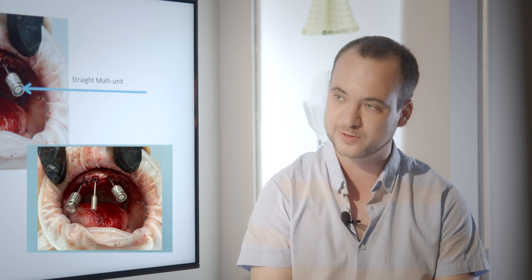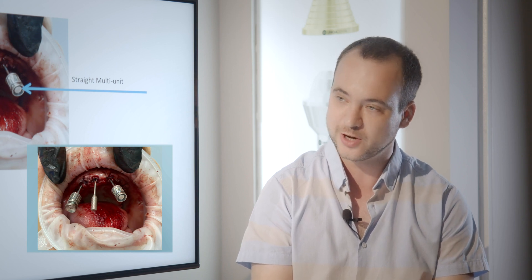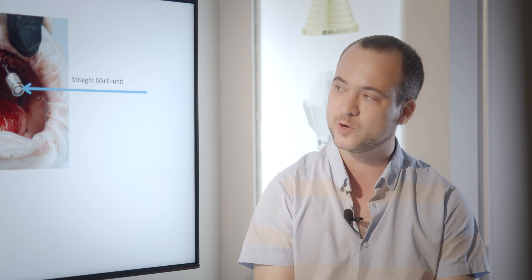After we place the implants, we preferably would like to place angulated or straight multi-units. If you place straight multi-units, you know right away where the screw channel will be, because the screw channel will be in the same axis of the implant, right above it. You can see by the axis of the hex key of the multi-unit the positioning and axis of the future screw channel.